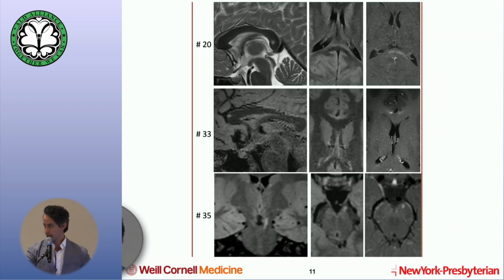And here it is again. Some of the more challenging lesions to identify sometimes are in the internal capsule and the brainstem, where you see it in cross-section here. And we're looking for these blushes, these tiny bits of lesional enhancement, telling us that the disease is active, and that is the reflex signal, at least right now, to go to stem cell transplant or gene therapy.